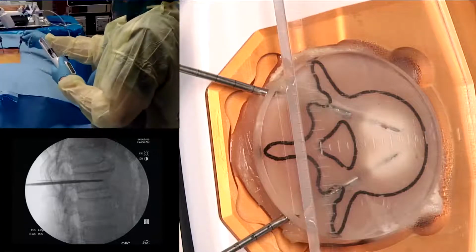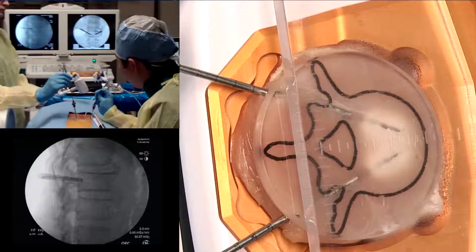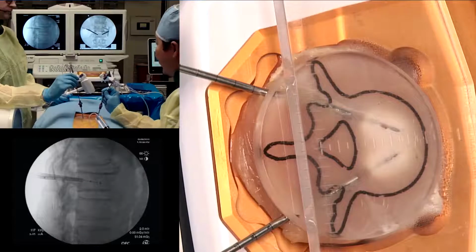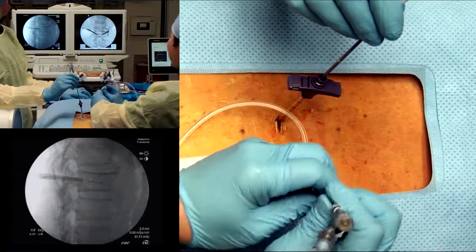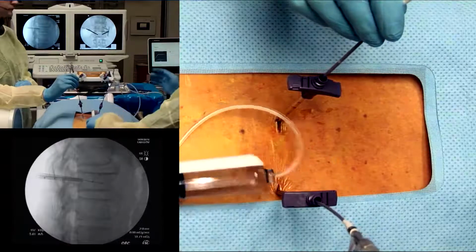So if we take a picture, you can see that you're not going to really see anything. But as I start slowly advancing this, picture that. You can see where that marker is. I'm going to try to go back to where I was previously. Picture that, which is right around there. And I think that's a pretty good place to be right there. Just slightly anterior to central.